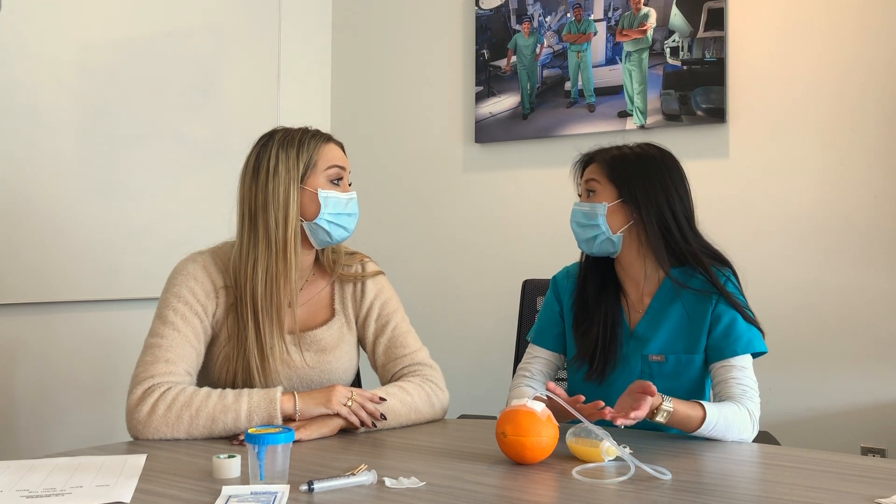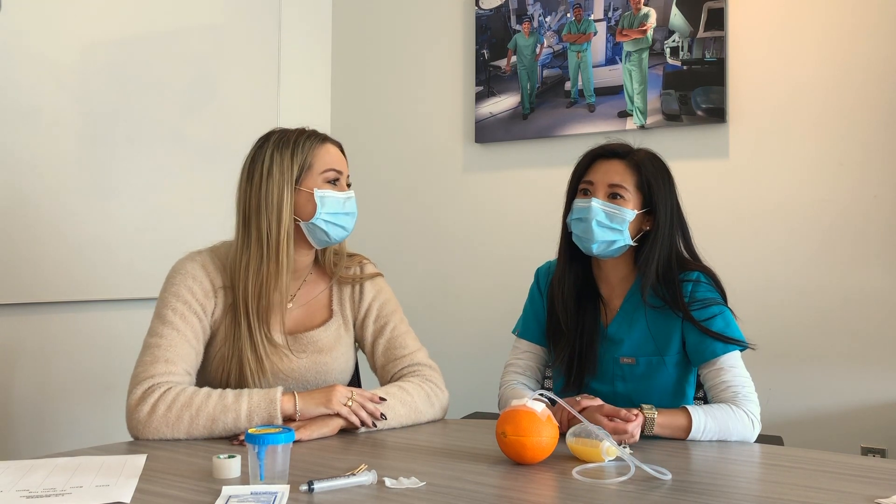I'm glad I don't have to take it out myself, but I'm still a little bit nervous honestly. Why is it so important to take care of your surgical drain? Caring for your drain is really important to ensure that it continues to work properly, and it's totally natural to be nervous, so don't worry about it. I'm here to help.